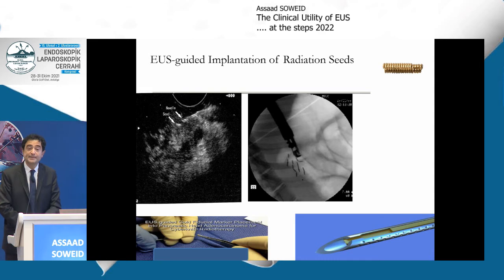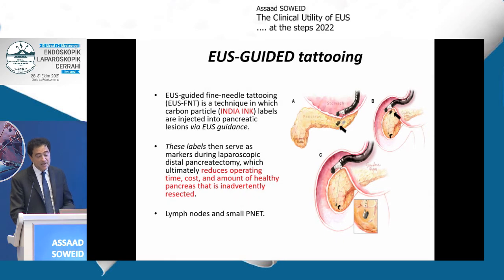We're doing a lot of placement of fiducials. We do have needles that can place 3 or 4 fiducials at the same time, and we can use them to mark a tumor by placement of these fiducials that are usually gold. And then our radiation oncology colleague will come in and will target this area if need be.